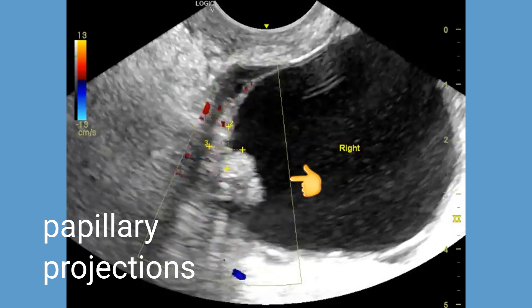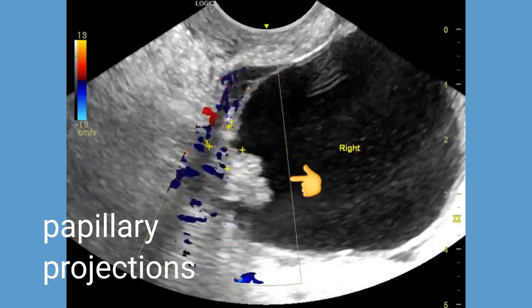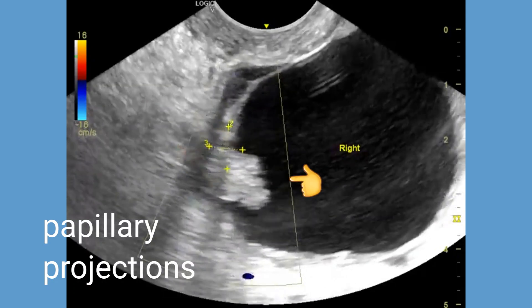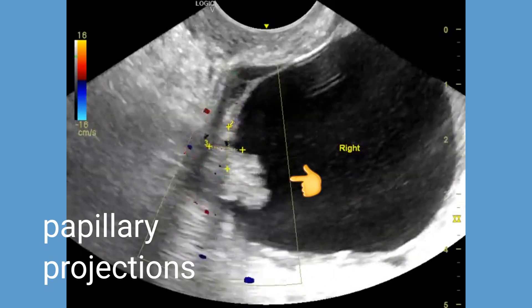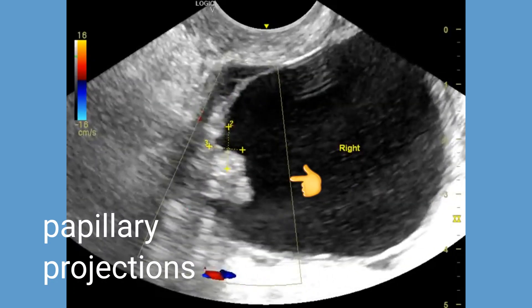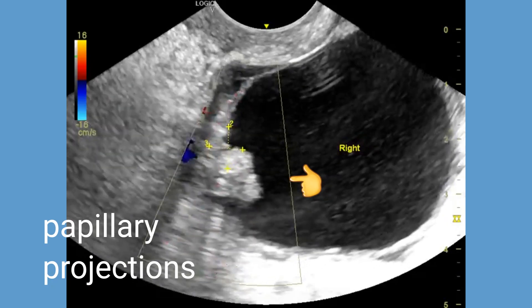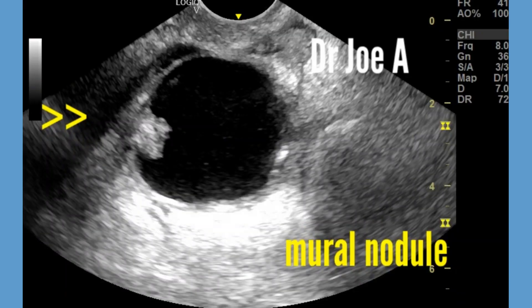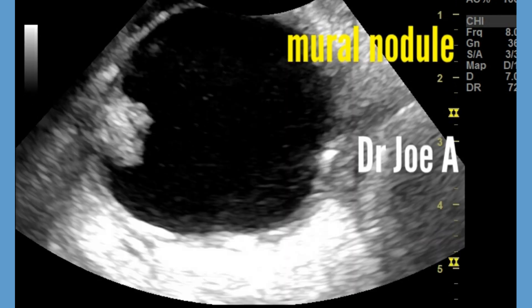Papillary projections are wall projections that are at least 3 mm in height and perpendicular to the wall of the cyst. They are suspicious features for malignancy, especially if they are involving more than 50% of the internal cyst wall.